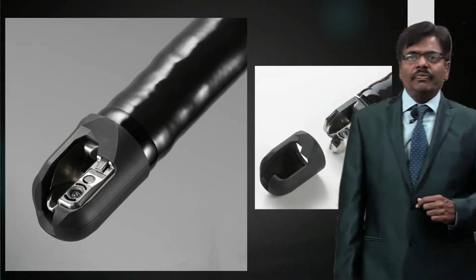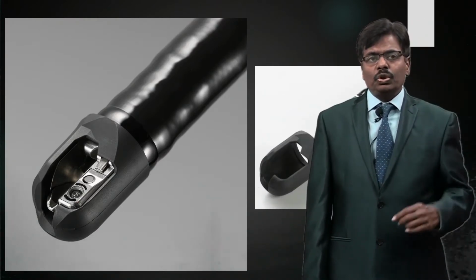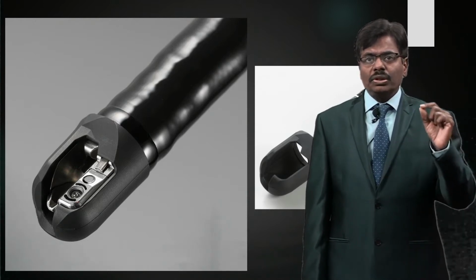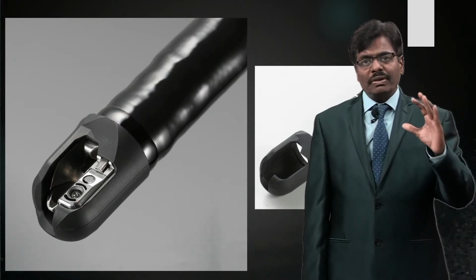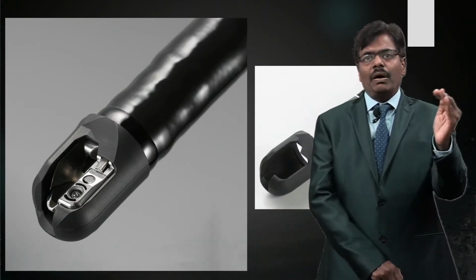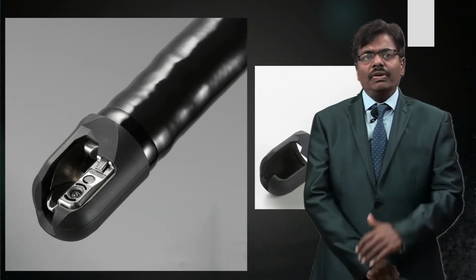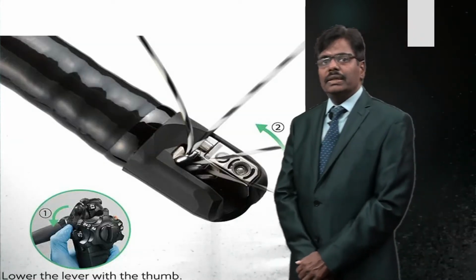And this is a close-up view of a Fujinon scope. As you can see, the tip can be disposable because the chance of Pseudomonas infection is so high. So you should have a rigid disinfection protocol in order to clean these intricate parts with the appropriate brushes and a good disinfectant, proper dwelling time. All those things have to be religiously kept.